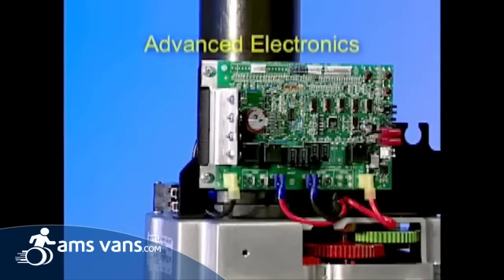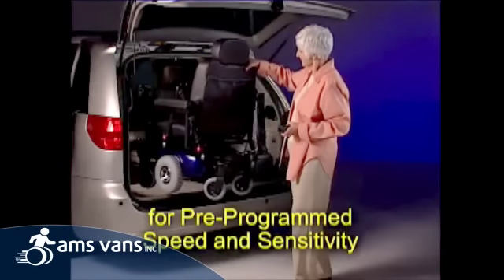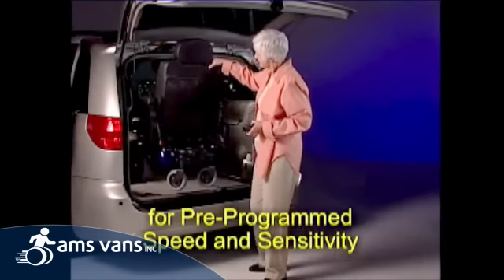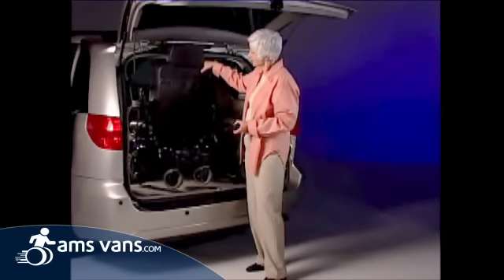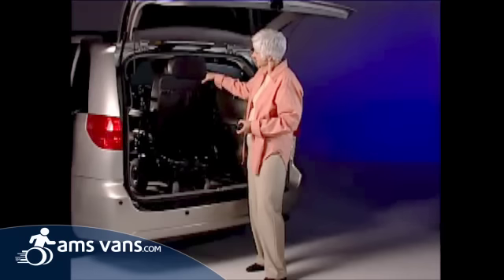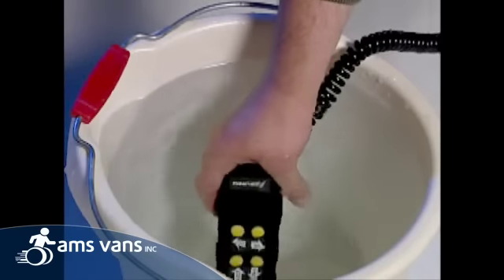The Curbsider features advanced electronics, which allow pre-programmed speed and sensitivity settings to accommodate individual user comfort. The standard control pendant can be upgraded to a waterproof exterior pendant.